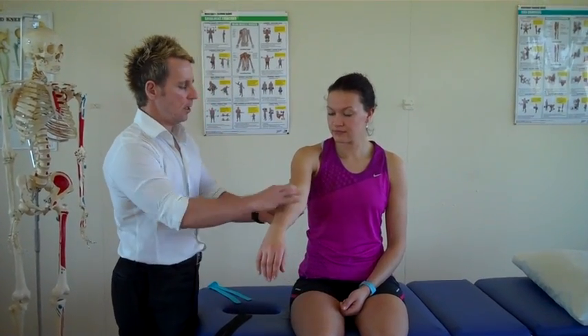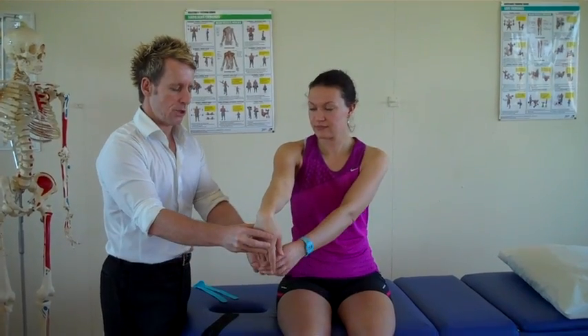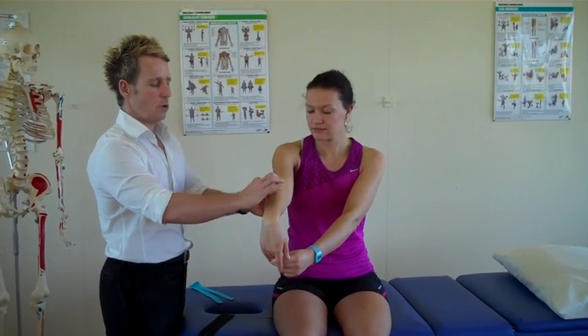First of all we're going to apply the tissue on stretch, and we apply that by extending the elbow, flexing the wrist, and asking the patient to hold onto the middle finger, so we are putting that tendon onto stretch.